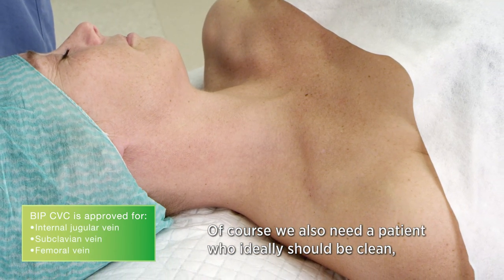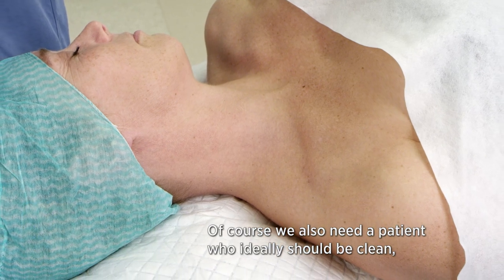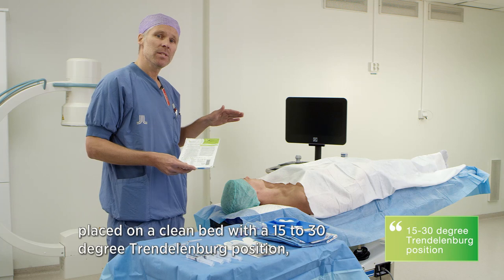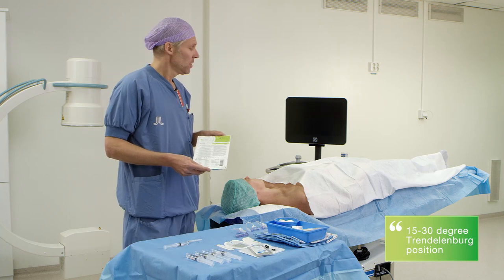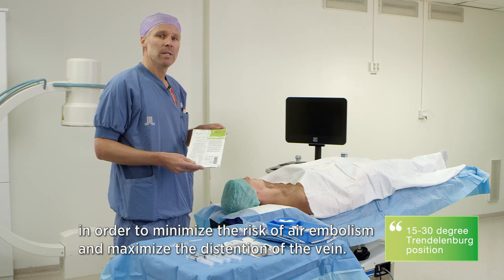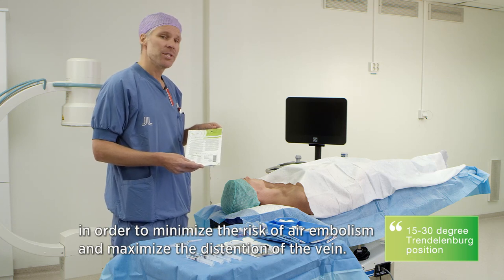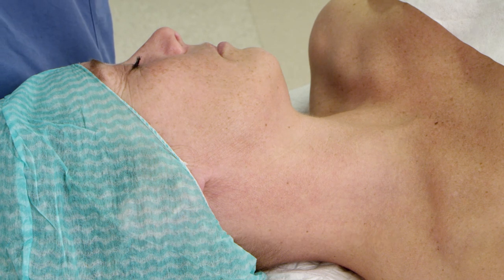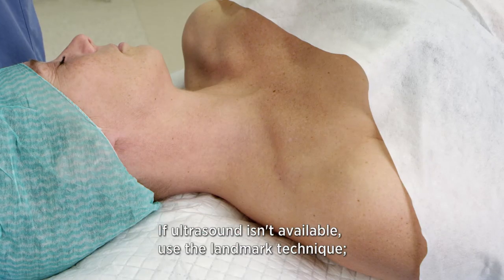Of course we also need a patient who ideally should be clean, placed on a clean bed with a 15 to 30 degree Trendelenburg position in order to minimize the risk of air embolism and maximize the distension of the vein. The face should be slightly turned to the left.